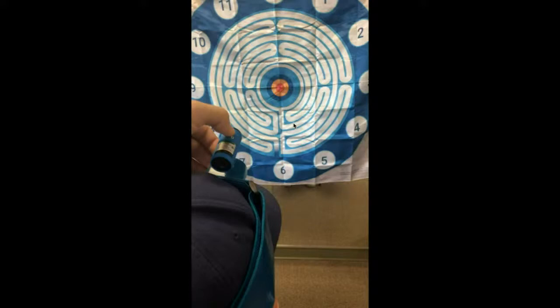Now, based on the current systematic review, I believe by DeVries, that was 2015, if you have 3 or more repetitions that are outside the standard deviation, and again, that would be this light blue field, then that's going to be considered positive for a joint position sense error testing. So if I do 3 tests and all 3 are outside the standard deviation, I can go ahead and move on from that. Now, if I do 4 tests and they're all inside the standard deviation, I can also stop testing, because that's not going to yield 3 positives for outside the standard deviation, and those would be considered negative testing.